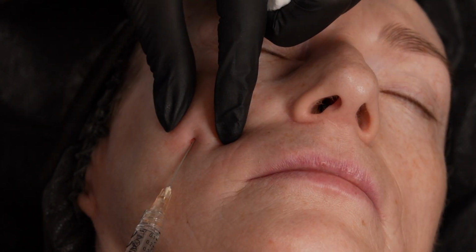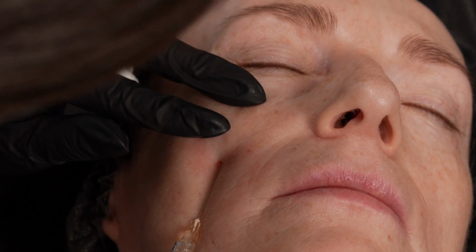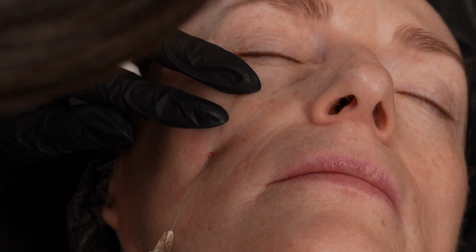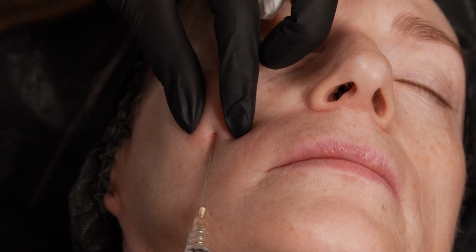She wants to correct the sulcus by being inside it, and I explained that it's better not to inject inside the sulcus. If there is a sulcus on the face, it's the way of the veins or arteries.